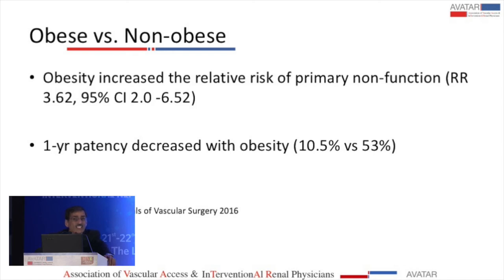There was one study that looked at using the HeRO device in obese patients, where there generally is a problem getting an AV fistula going, or even if a graft is placed, the graft may be difficult to keep superficial, and cannulations may be a problem. And in these patients, the thought process was, can we use the HeRO device as a primary access?